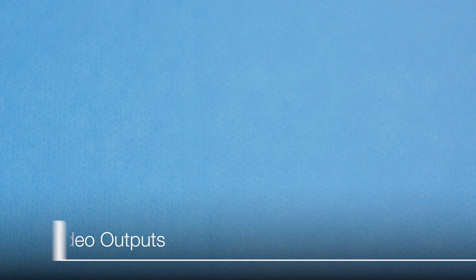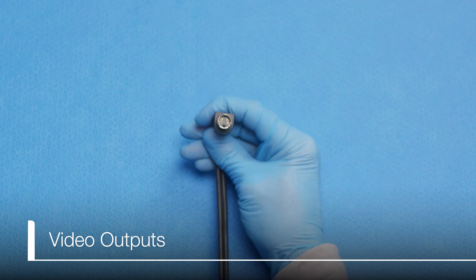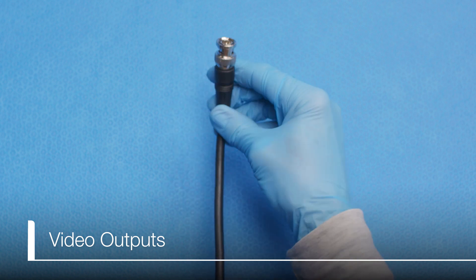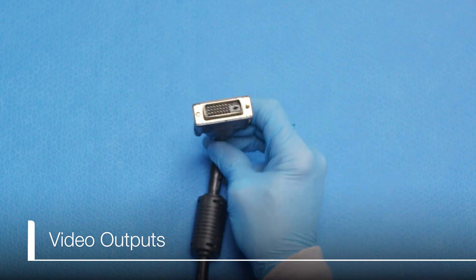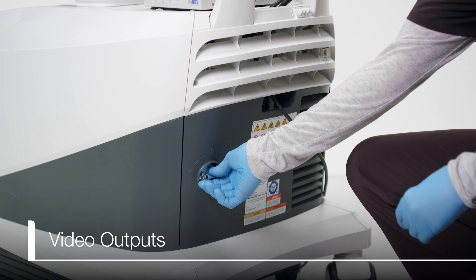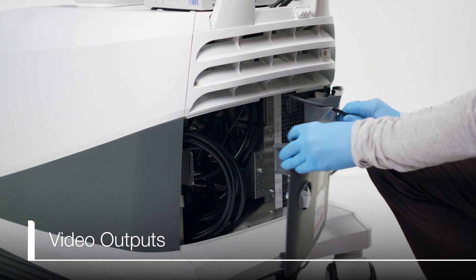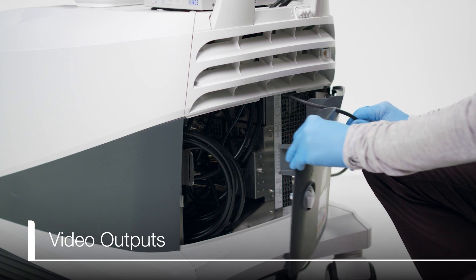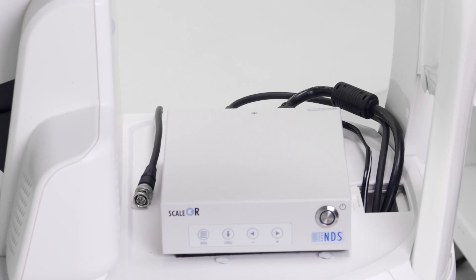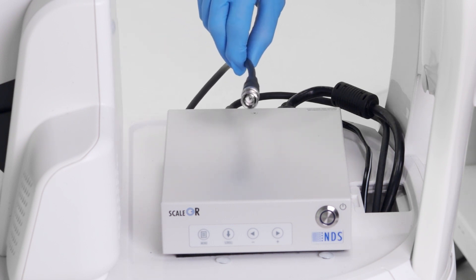There are multiple choices for outputs on the Arrieta 850: Composite, YC or S-Video, SDI, and DVI. The YC, Composite, and DVI outputs come from the back of the Arrieta 850 and are easily accessible through a door on the back of the processor. The SDI output comes from the DVI to SDI converter box, which we will discuss next.